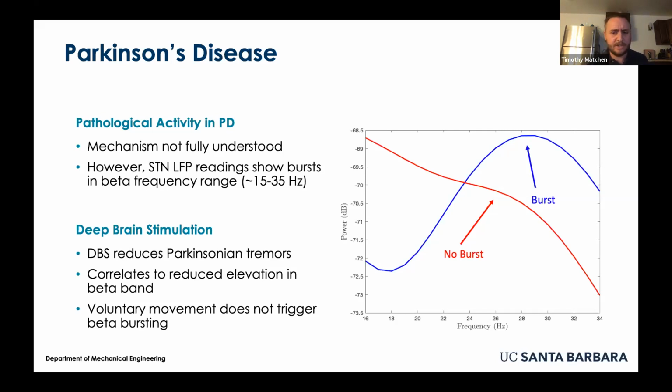So these are the core issues that we're trying to answer with this. Like I said, because it's a very difficult area of the brain to look at and to make really conclusive, definitive statements about, we thought that a good approach would be, instead of trying to find the specific how and why, to look at it from a broader perspective: can we understand something about the data that we get and use that data to say something intelligent about the system? And to do that, we turned to machine learning, and specifically neural networks.